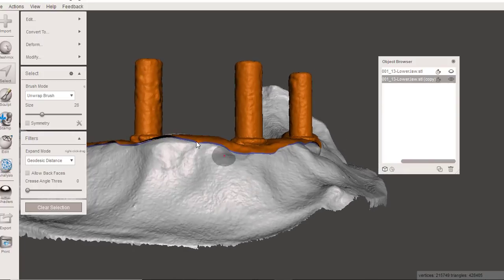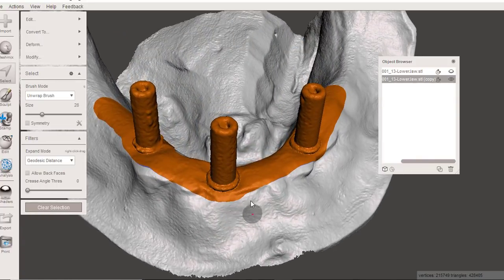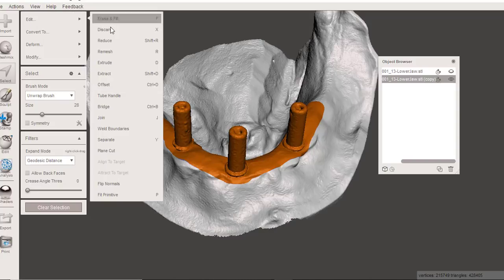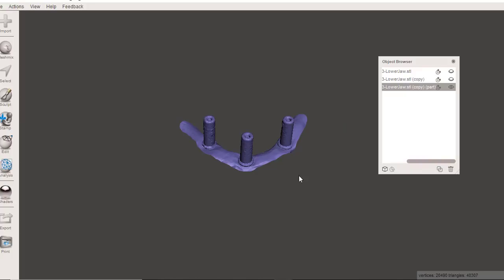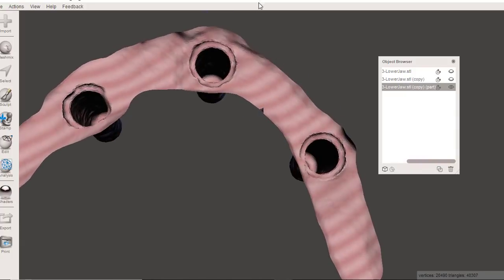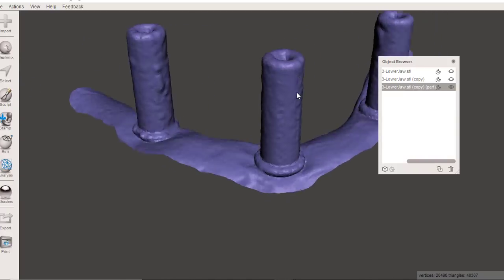Now it doesn't destroy the original underlying mesh, it just creates a new one. But now it's all still part of the same STL. Notice that there's not any new STLs over here. So with this still selected, come up here to your edit menu and tell it to separate it while it's selected orange like that. So now we have a new surface. And you can see this surface right here. It is still just a one-dimensional skin though right now. This is not any kind of an object that you could print.